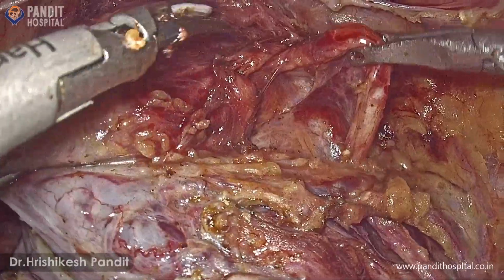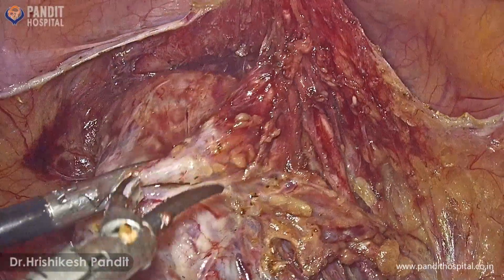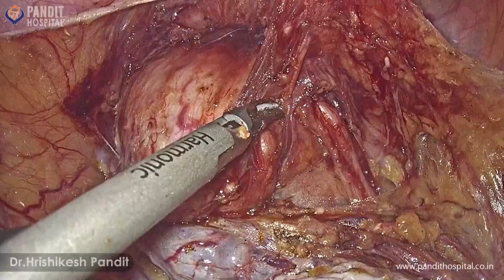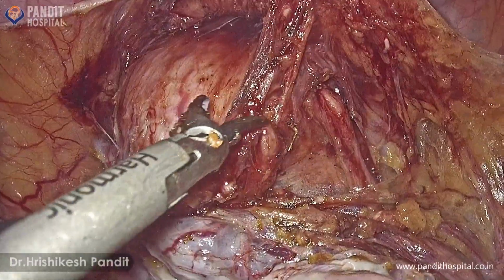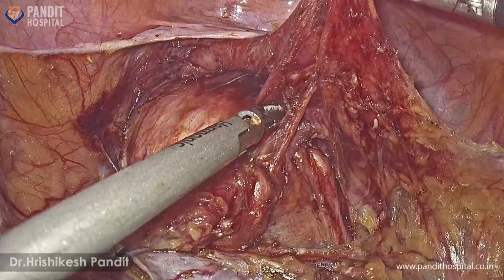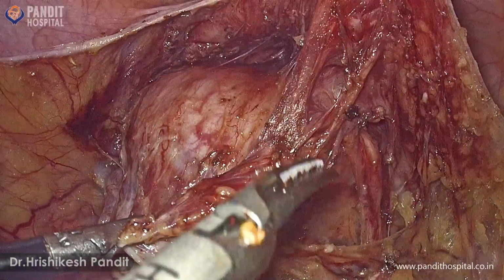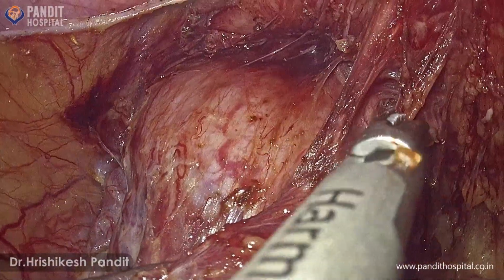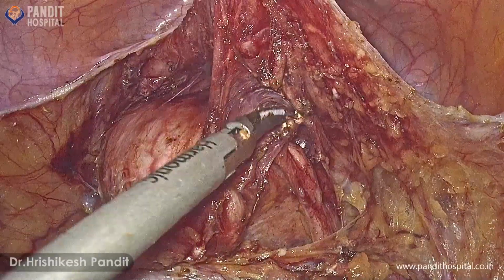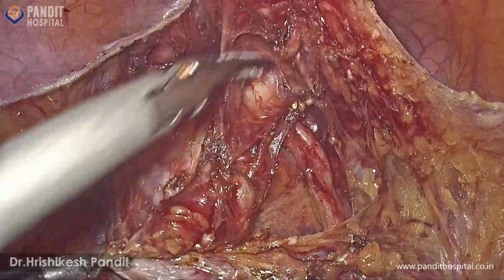Improper handling of tissues at this step can lead to tearing of blood vessel and soiling of the entire operative field. We can clearly visualize the importance of adequate traction and counter traction at this point, both by the surgeon and the assistant. It is important to know the limit of dissection of the ureteric tunnel so as not to enter into the bladder.